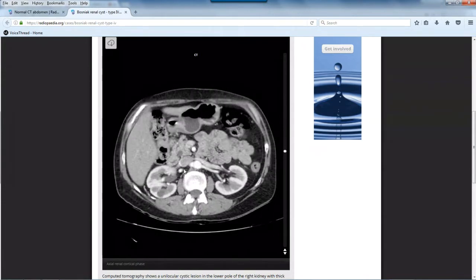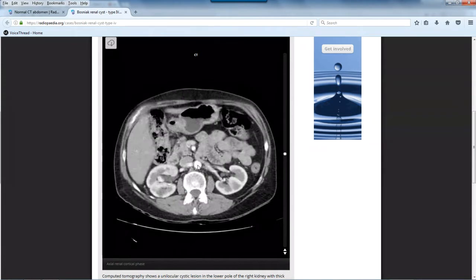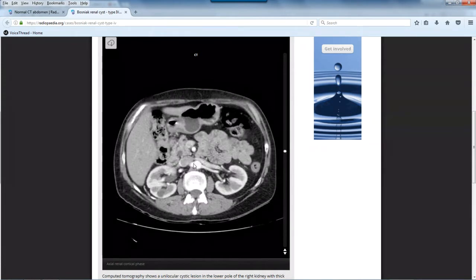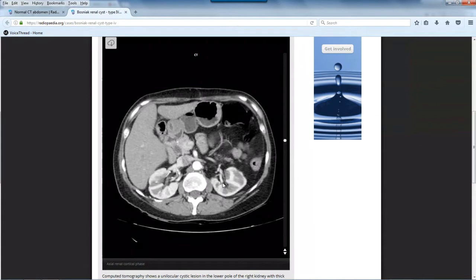The right is slightly longer than the left because the aorta is slightly to the left of midline. Okay, so follow it over, and this is where you have to follow up and down because I can see where the left is coming off, which is a little bit higher than the right, which should make sense. I can see a good sweep of it, a good stretch of it here, but I'm losing where the end of it is here, so I have to go down a little bit. It actually goes down a little before it enters into the hilum of the kidney.